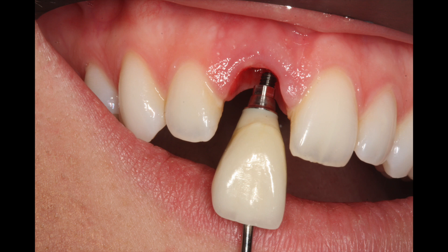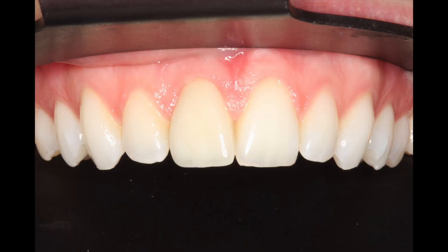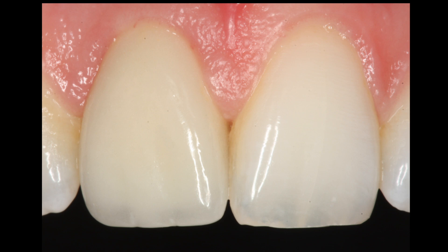You can see the aesthetics of this particular case. The papilla is being held by a temporary, and then we come back in with the ASC abutment and can duplicate the exact shape and size of the temporary crown to make an excellent result. The patient will really enjoy the crown for many years to come. It's a very great advancement in implant dentistry.